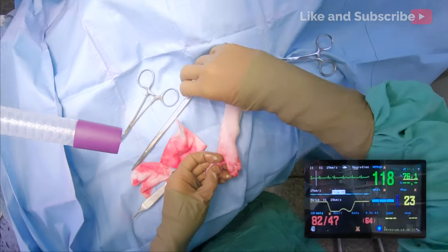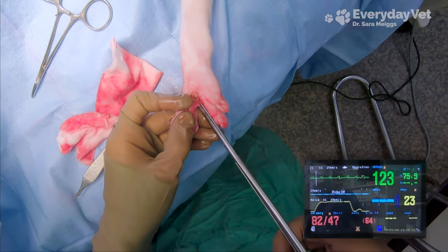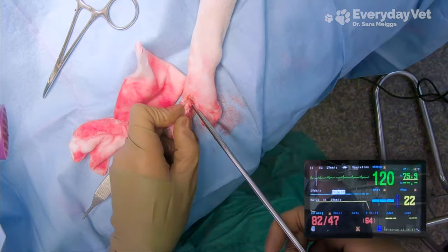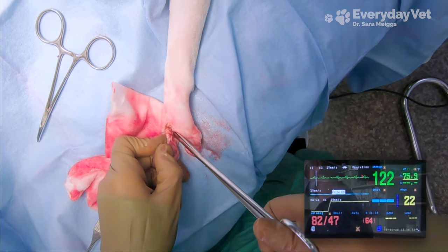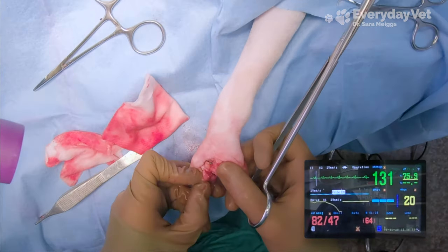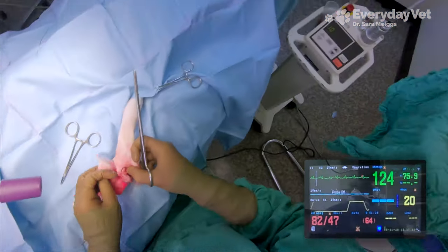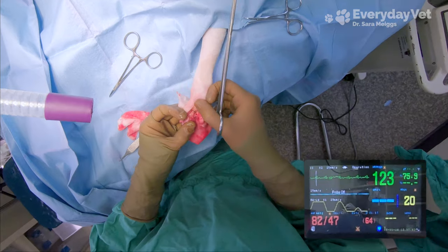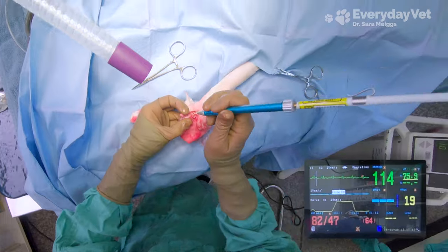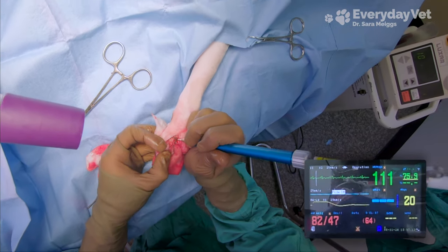I still need to get a little bit further down into that joint, so I'm going to keep working my way around it until I get all of the connective tissues loosened up. Right now I'm doing what's called blunt dissection — I can use the tips of the scissors, keep them closed, stick the tip into the actual tissue, and then open up so it bluntly spreads those tissues away. That way I don't accidentally cut through any of the tendons, ligaments, or blood vessels going to the surrounding toes. Now that I've got it spaced out, I can use the laser to make small cuts in the connective tissue to free up that joint.